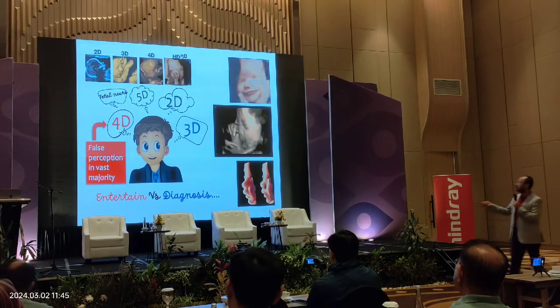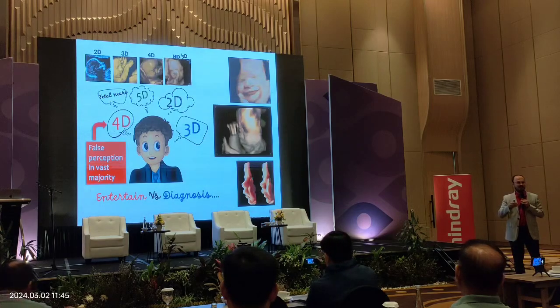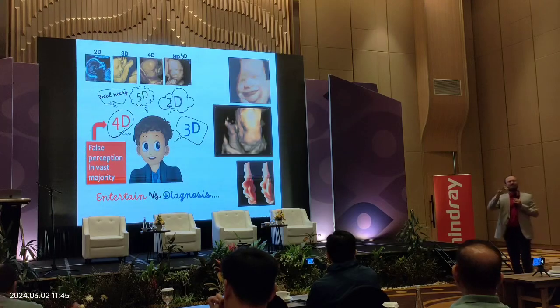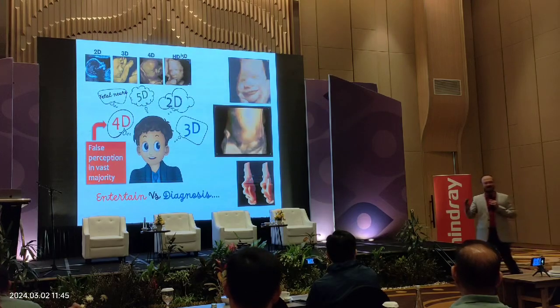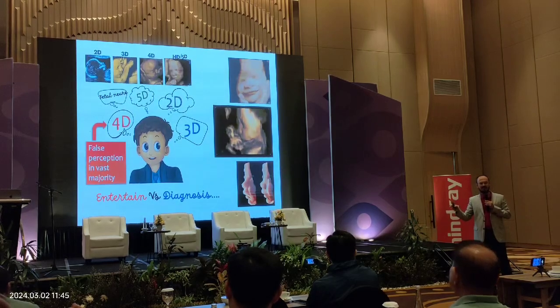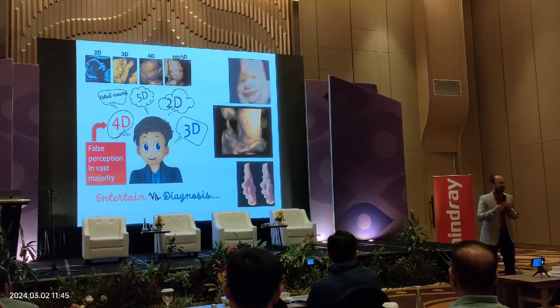The term 4D is about doing 3D with motion. Okay? 5D: there is no term 5D in scientific or academic usage. 5D is only a term used for entertainment.